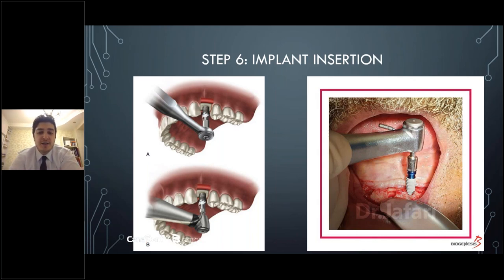If the implant is tightened into the osteotomy and significant stress occurs at the crestal area, pressure necrosis may occur and an increase in the devital zone of bone around the implant during the healing period. If this should occur, you must not put a lot of force and try to insert it, saying, okay, go in, I did all the drillings of the appropriate type. Some bones may not be expanded by the amount that we need. If this should occur, the implant may be unthreaded in reverse, 1 to 2 millimeters, and then go in again.